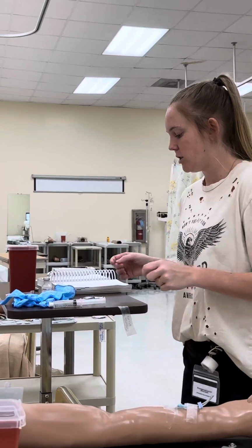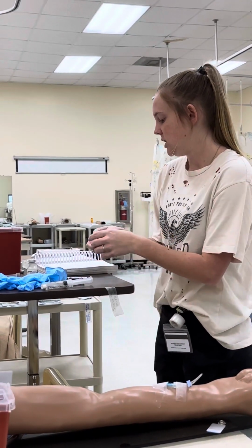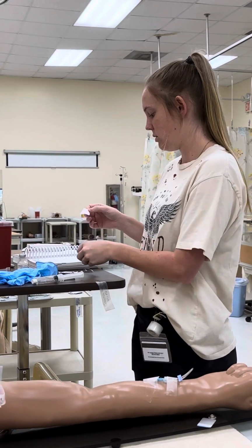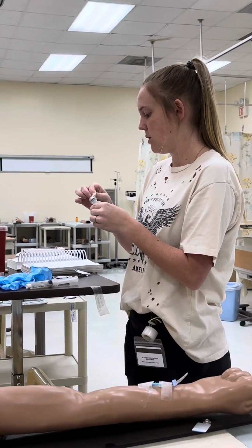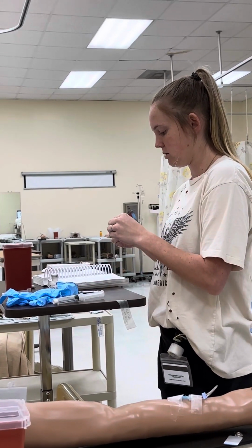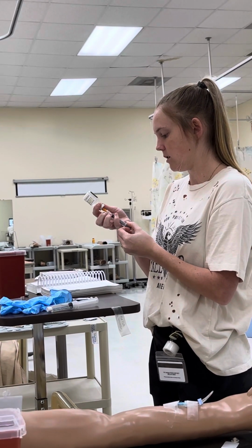I'm then going to make sure that I have all the appropriate equipment, that it is in date, and that it is not contaminated. I'm going to perform hand hygiene and draw up my medication, remembering the rights to medication: right time, right route, right dose, right medication, right patient, right documentation, and right indication. And then draw up 4 milliliters of furosemide.